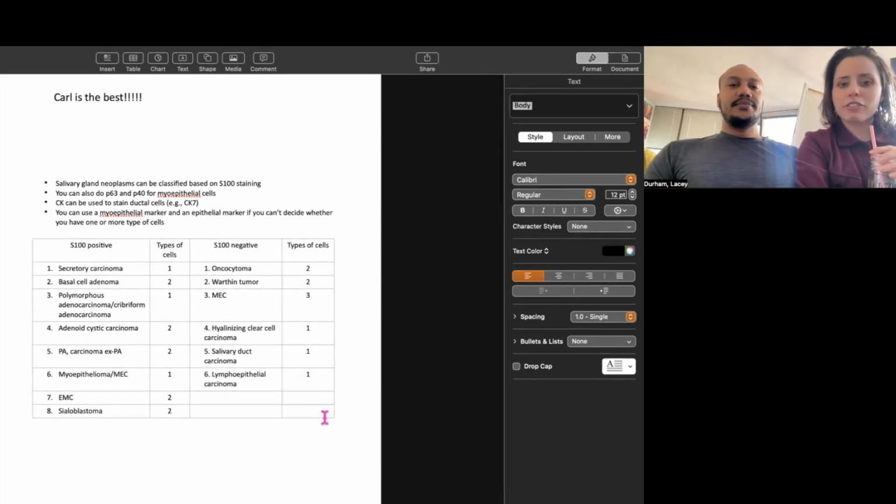So that's our lecture. I feel like that's a good stopping point. I wish I understood these actual entities a bit more, but I think this is good for especially understanding your flow. Thanks to Dr. Carl, the best. Dr. Carl, the pathologist, and what part of Canada is he in? Vancouver. In Vancouver, Canada. I will keep y'all posted on how I use this.